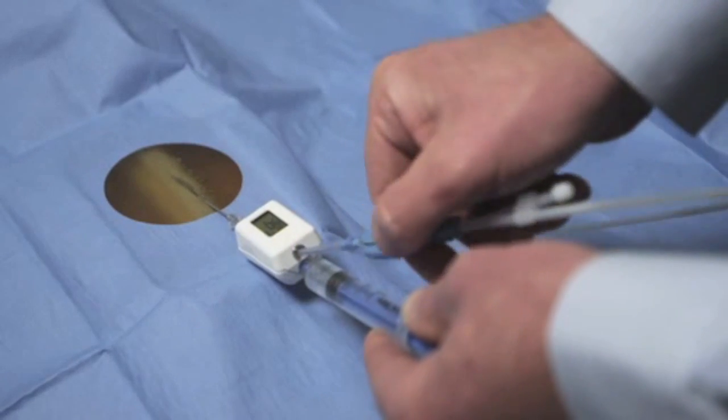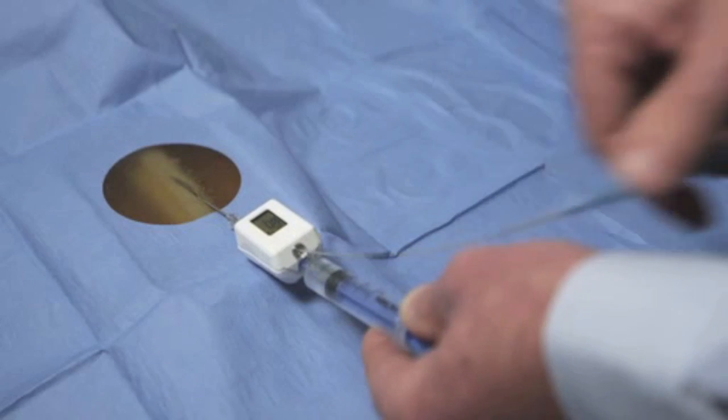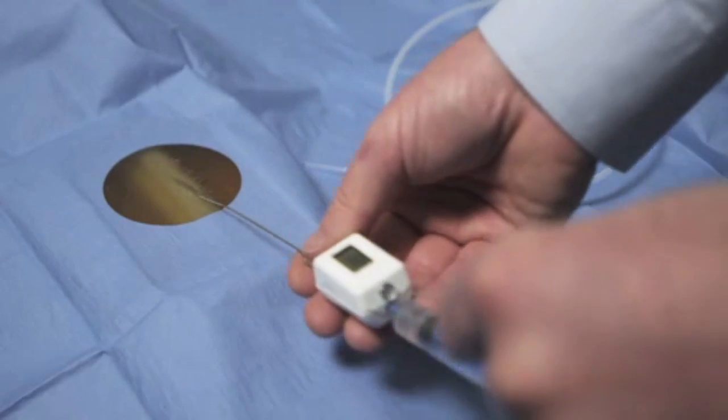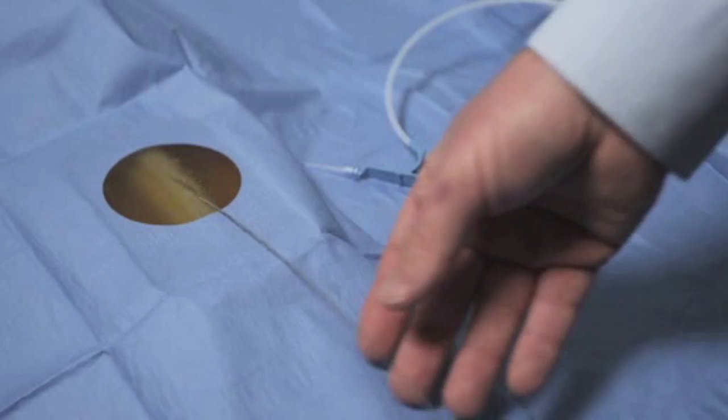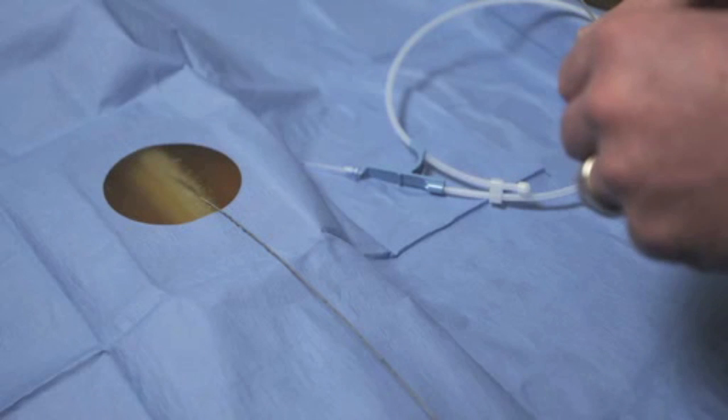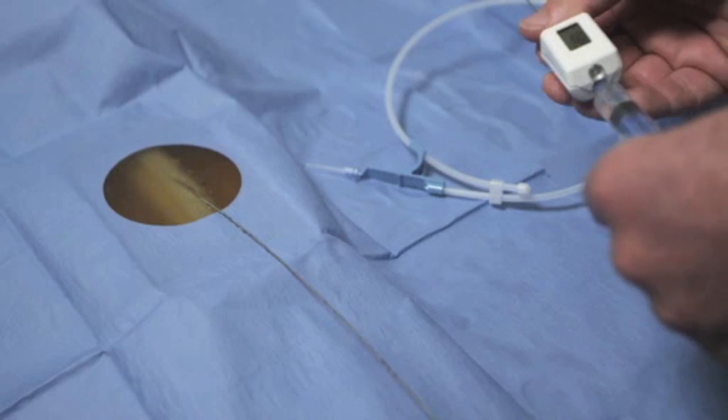Once the guide wire is fully advanced, the device assembly can be removed in its entirety from the guide wire, and the practitioner can continue with dilation and placement of the central venous catheter.